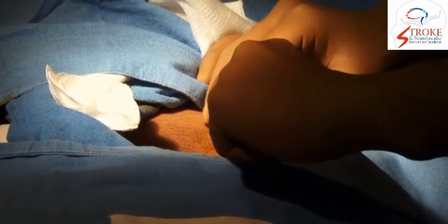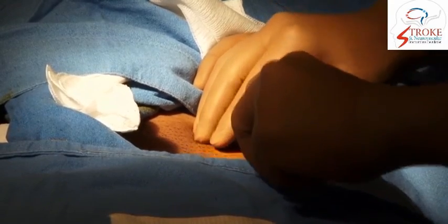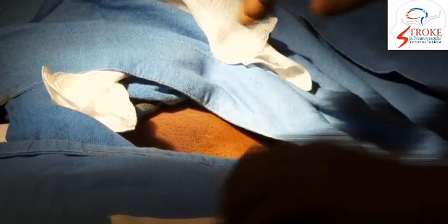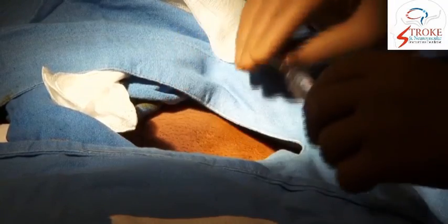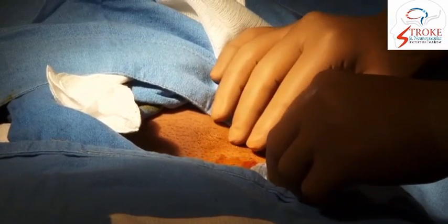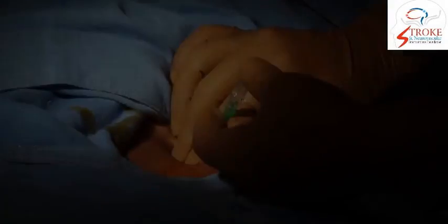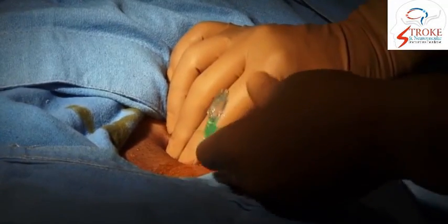We always like to have very close neurological and hemodynamic monitoring during the procedure, and we almost always have a neuroanesthetist in the procedure for the hemodynamic monitoring. Local anesthesia is being given. We have taken a left transfemoral route in the procedure, artery being punctured.